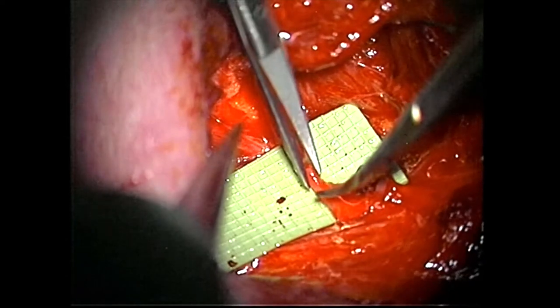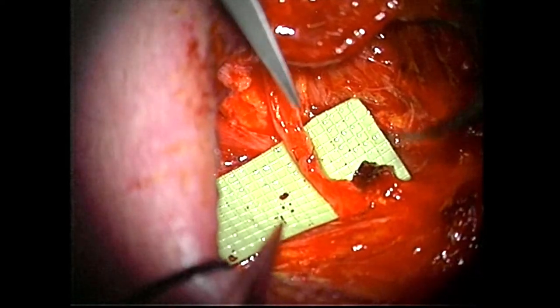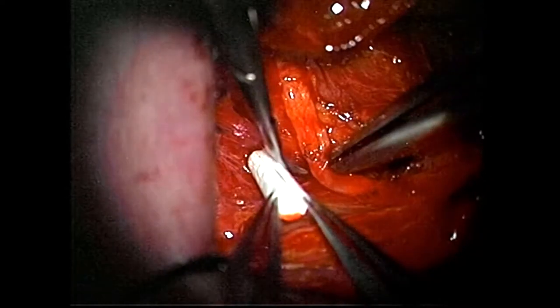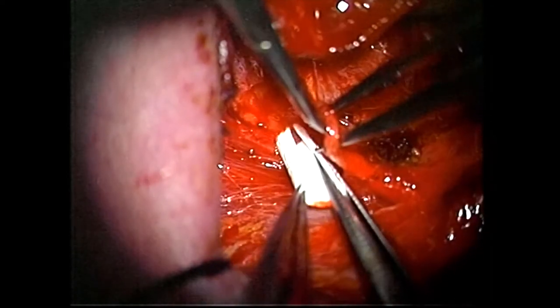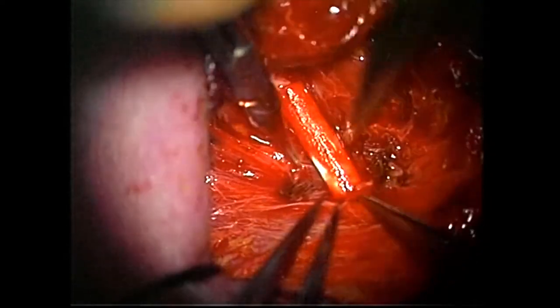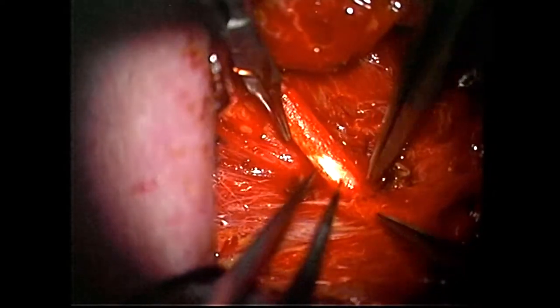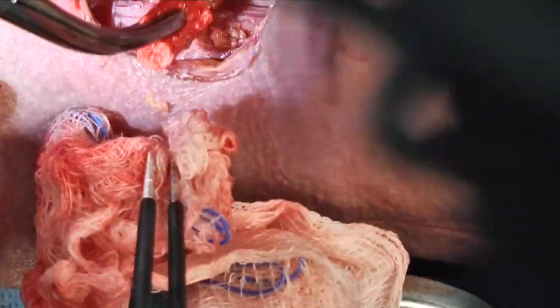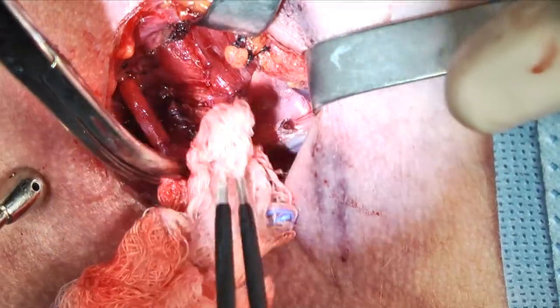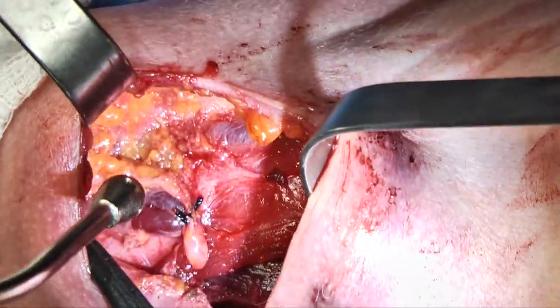Here we're tying these down and clipping the sutures. It's a nice position there. Then I do a belt-and-suspenders thing with a collagen tubule called a NeuroPore Tubule — there are other types — and just lay that in place so that it's not going to grow anywhere else except within that tube. Then I rinse it out carefully, look for any bleeding vessels, achieve hemostasis at the end, and lay the muscles back over the top.